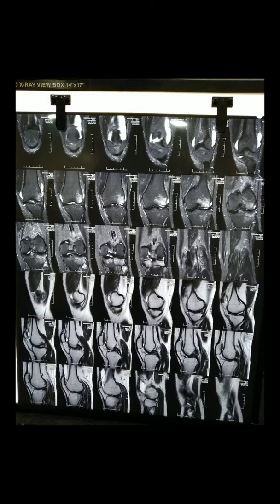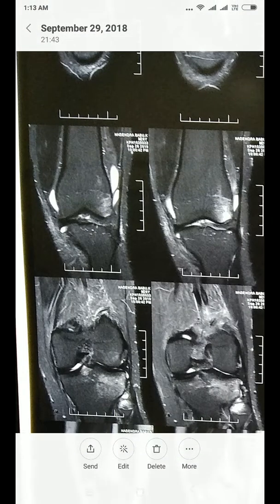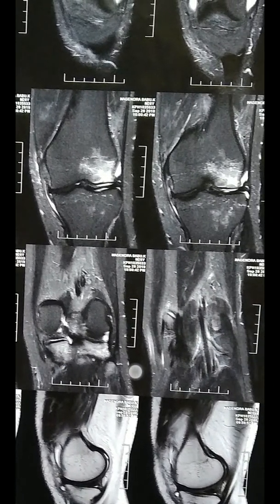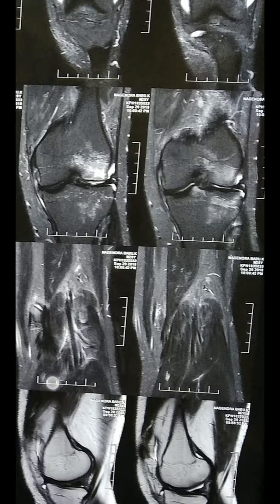Now we are seeing the T2 coronal images. In T2, fluid appears white. Quadriceps tendon and patellar tendon are looking normal as we go from front to back. There is some effusion there. And as you see here, there is a contusion of the lateral femoral condyle. There is a bony contusion of the lateral femoral condyle and also the tibial plateau.